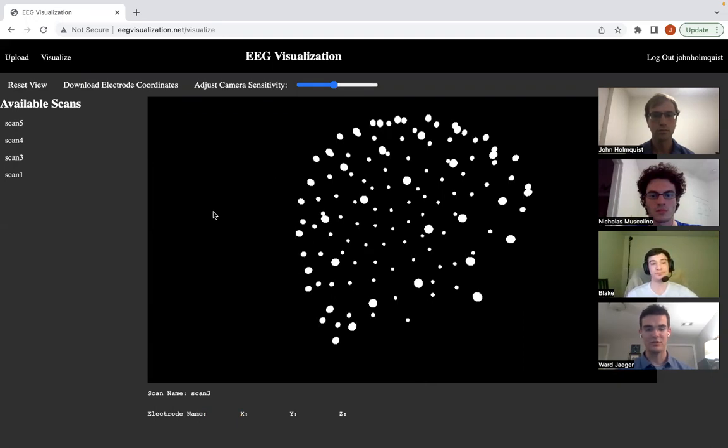To calculate these electrodes, we took in the point cloud and we first performed color thresholding on it. Since all of our electrodes are either black and white, we want to isolate those points that have a low color saturation. After thresholding, we perform outlier removal, where we take all of the points that have many neighbors and keep them, and remove all the points that have few neighbors from the point cloud. This works because the points inside of the electrodes should have many neighbors, while other points associated with the wires or other details in the scene will not have as many neighbors.